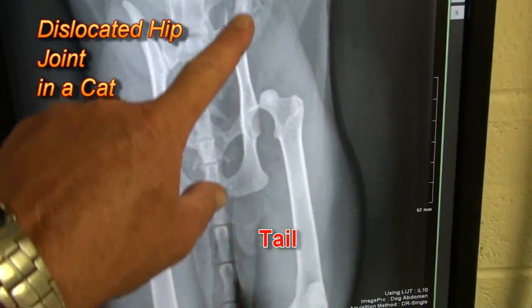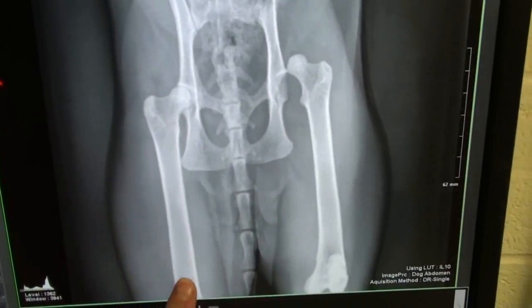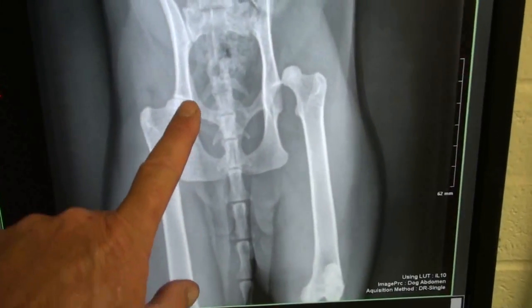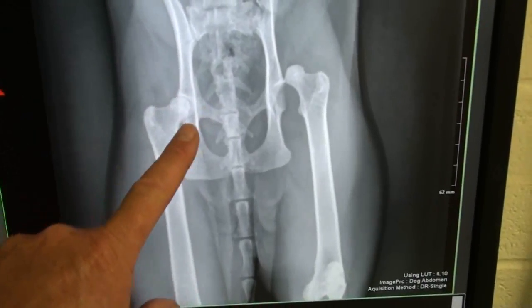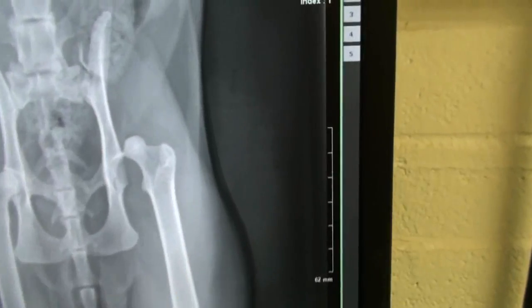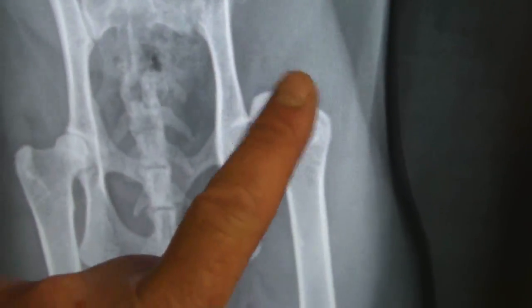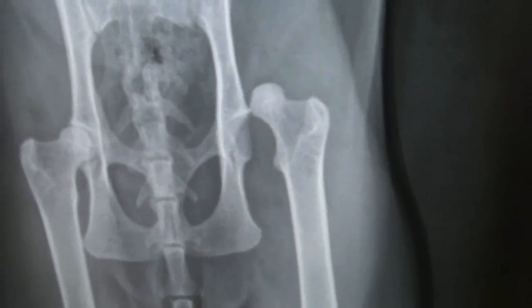Here's the pelvis, here's the right femur, and here's the ball of the femur in the socket. And here's the left femur — if you go up here you can see the socket and the ball. It's out of the socket.